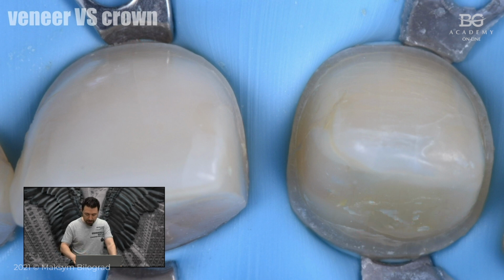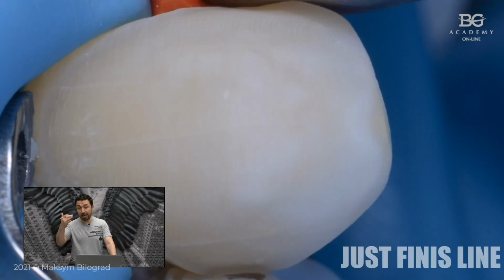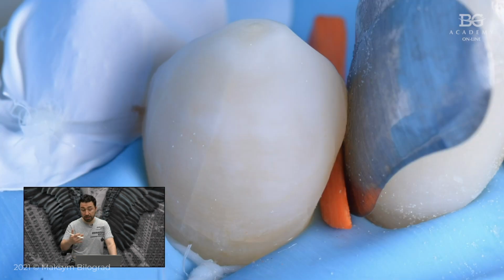Here is the vestibular aspect, a nice image of the lateral incisor, just a finish line, just delicate proximal preparations. The canine that I was afraid of at the very beginning during consultation: no dentin exposure, zero, so we are in enamel, a very conservative preparation. Another canine, same thing, very delicate preps.